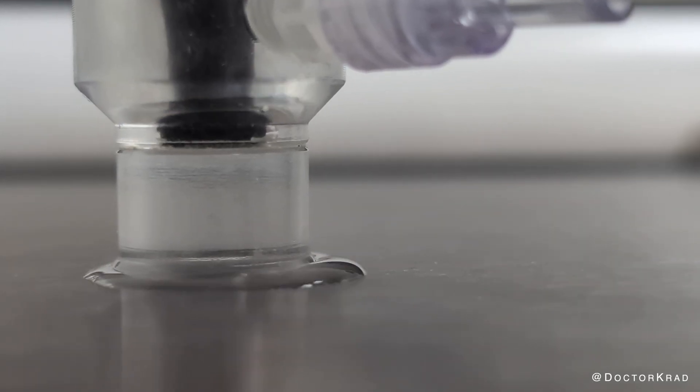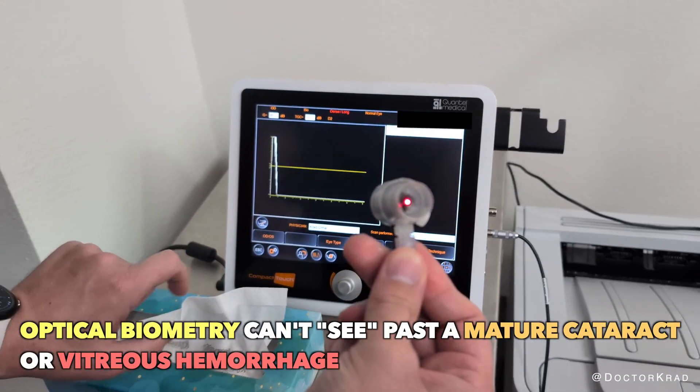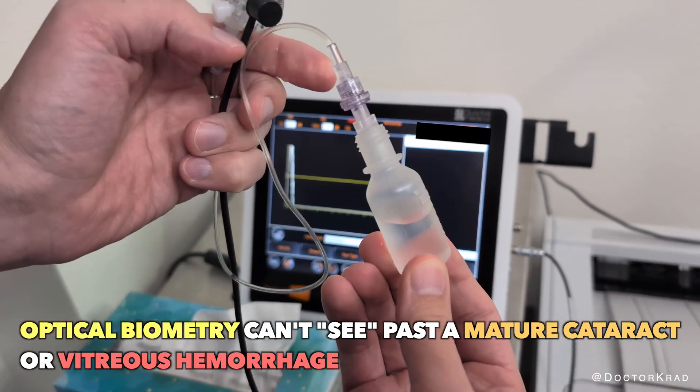Hi everyone, it's Dr. Krat. When someone has a mature or very dense cataract or a vitreous hemorrhage, ultrasound becomes necessary to measure the length of the eyeball.